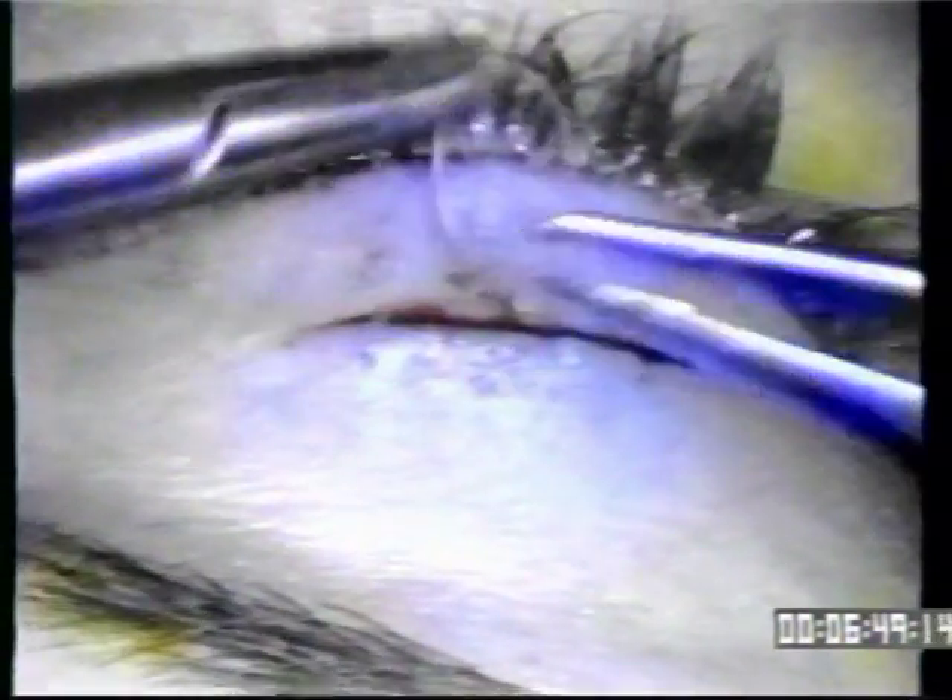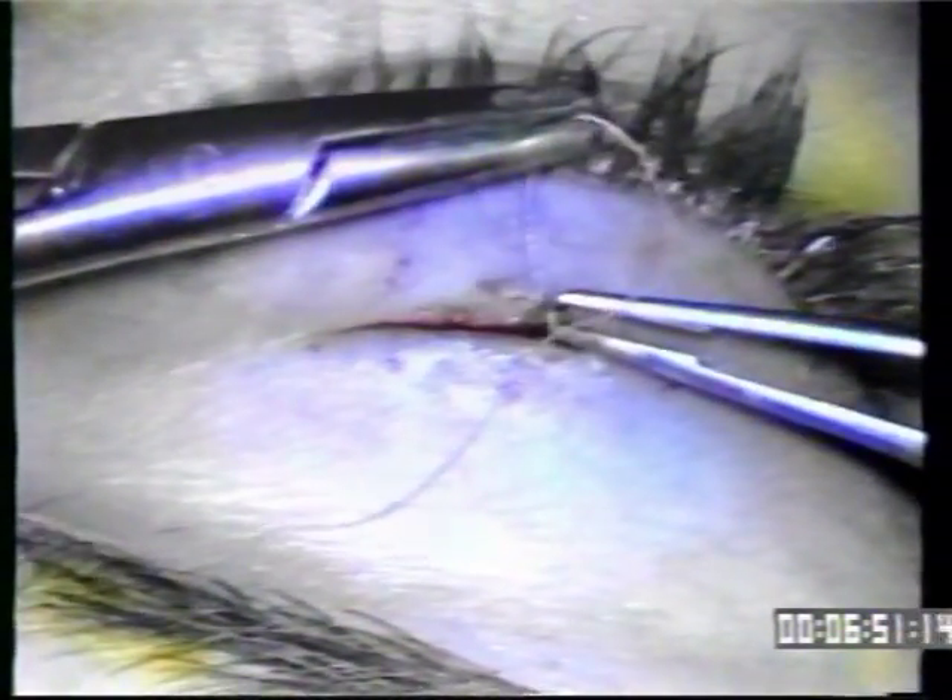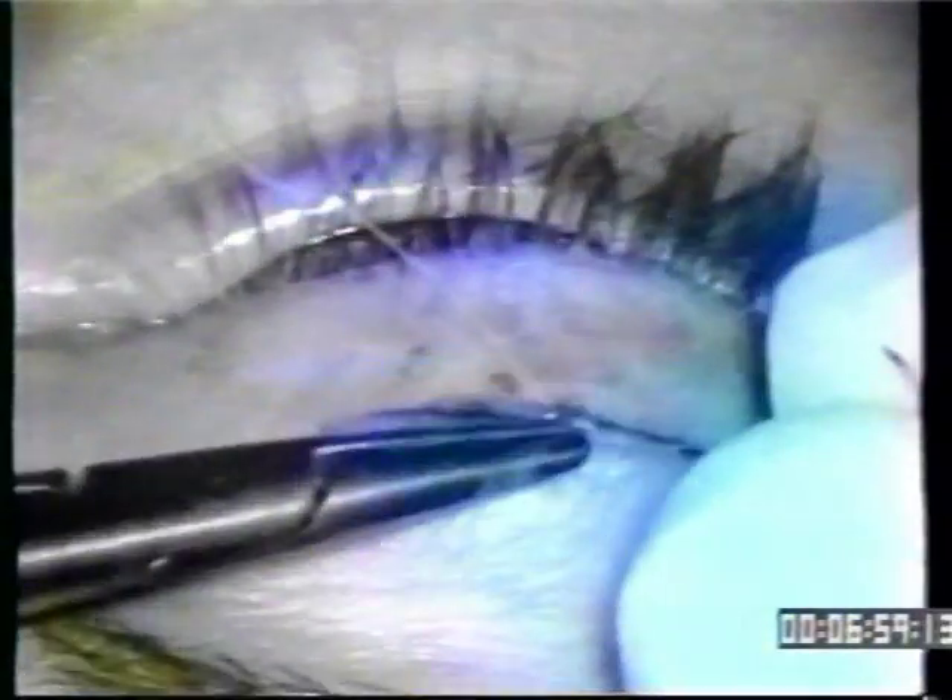Finally, 6-O chromic is used to close the skin. These sutures do not have to be removed. One or two sutures are all that is necessary.